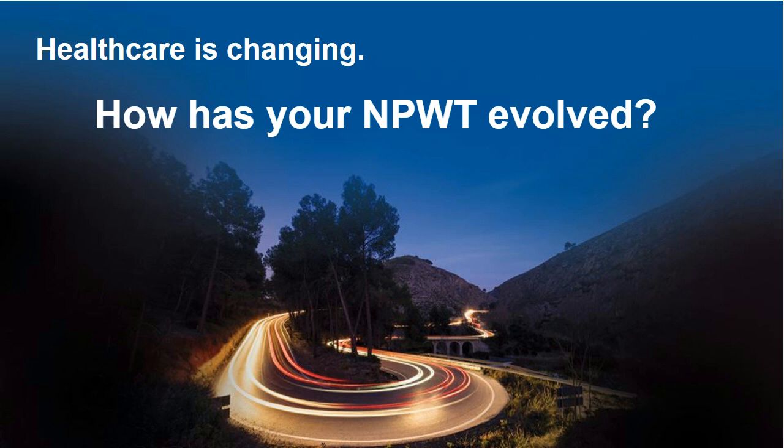So 2 hours is a critical thing for negative pressure. Yes, that's where we were going with that. Yes, I misunderstood the question. We have a 2-hour window, and if that exudate stays in there longer, it's a medium for bacteria growth. Yep.